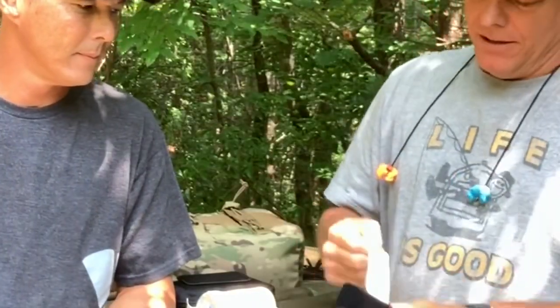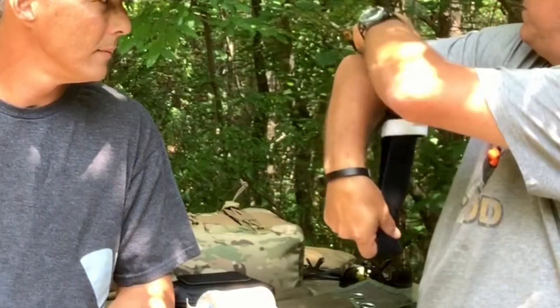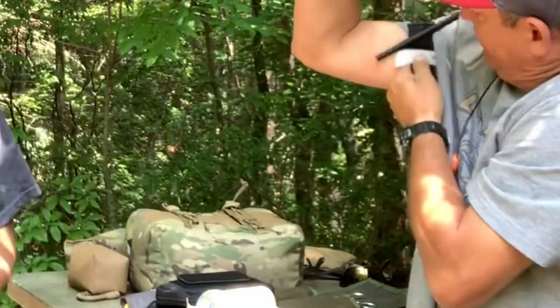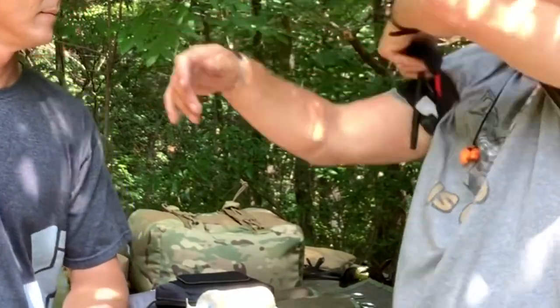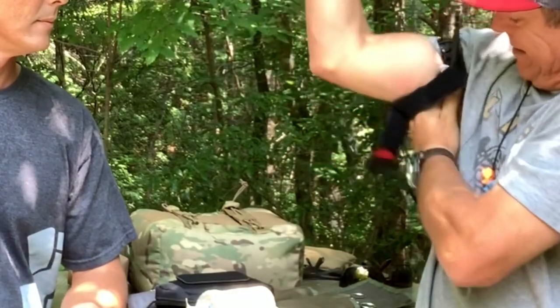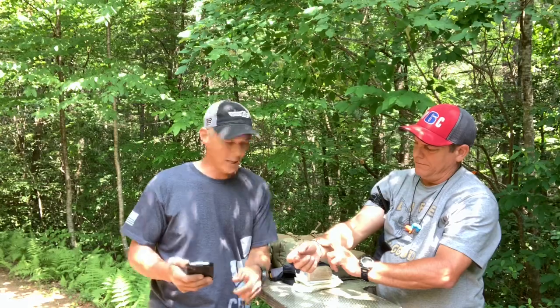All right, pull the strap off. All right, throw that out of the way. Couple twists, and we're done. That only took him like 30 seconds. Let's go ahead and take that off.